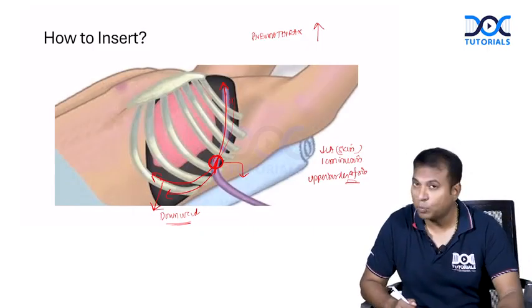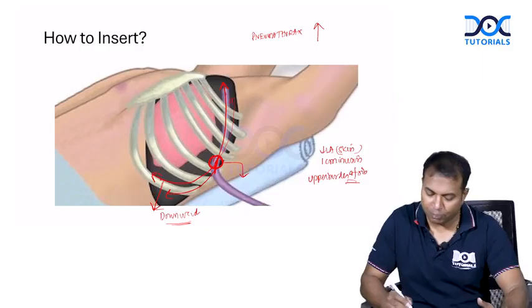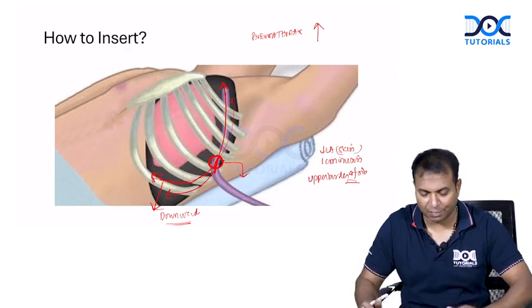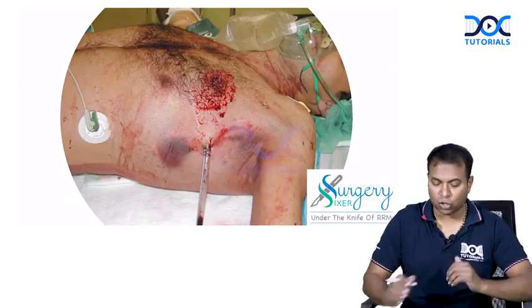Okay, don't forget these 2 points. So we do an intercostal drainage tube after esophagectomy and all, we point it downwards only. We point it downwards to remove any collection which is happening after esophagectomy. Okay, so this is a very important concept. Don't forget about this in insertion of an intercostal drainage tube.